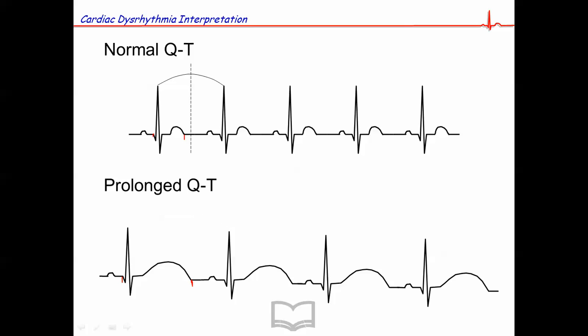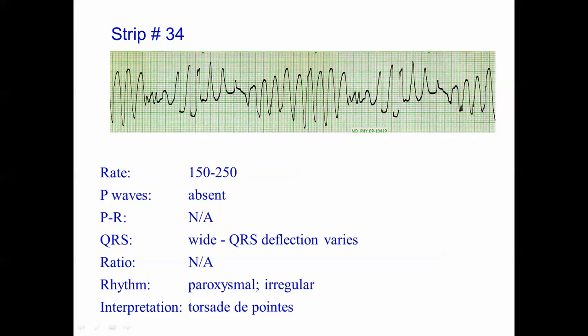Again, this is a polymorphic ventricular tachycardia in which the heart rate is typically between 150 and 250. There are gradual changes in the QRS amplitude and twisting of the QRS. It may be upgoing, then downgoing.